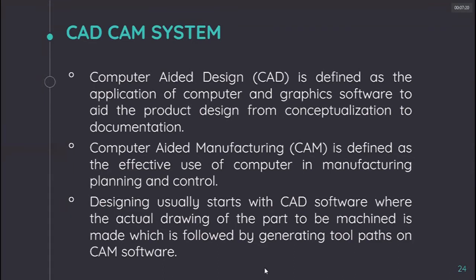Designing usually starts with computer-aided design software, where the actual drawing of the part to be machined is made, and then it is followed by generating toolpaths on CAM software.